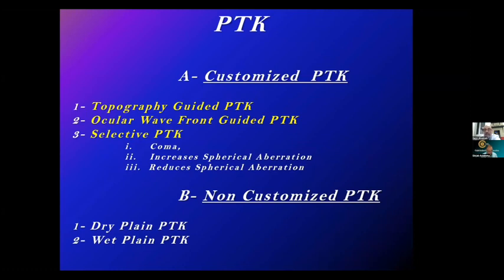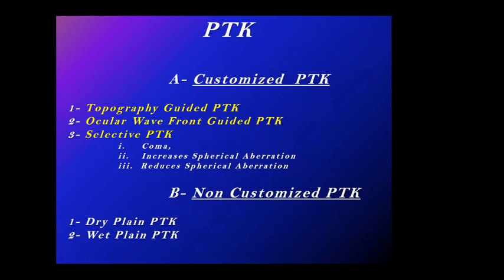Customized PTK may be topography guided or ocular wavefront guided, or selective PTK. Selective PTK is for selective errors, like coma or spherical aberration: only to correct spherical aberration, only to correct the coma, or to induce spherical aberration in case of presbyopia.